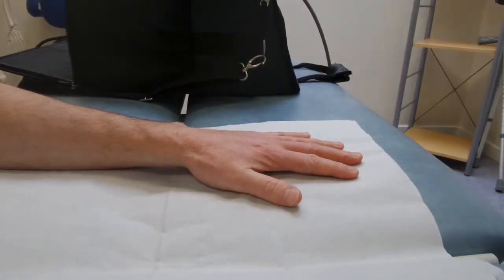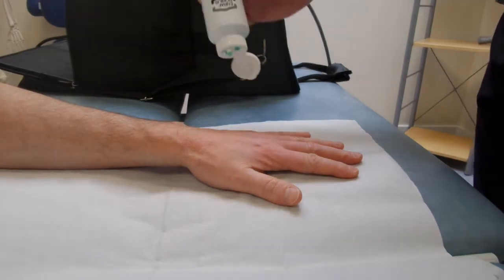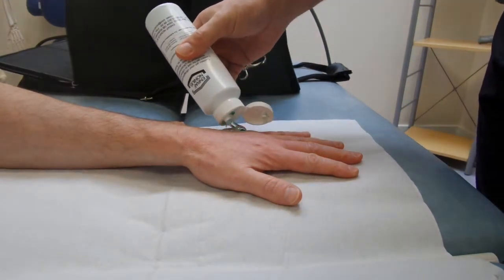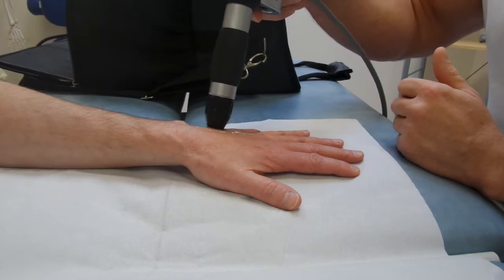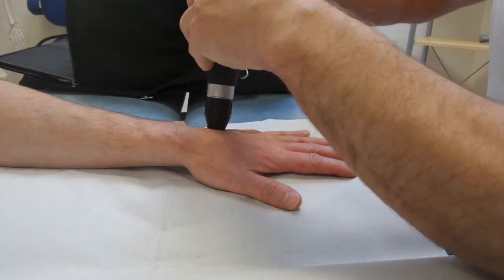We're back with the hand now. Apply some gel into the gutter between the two metacarpals. This is where the scar tissue is. Just spread out the gel and start the shockwave.